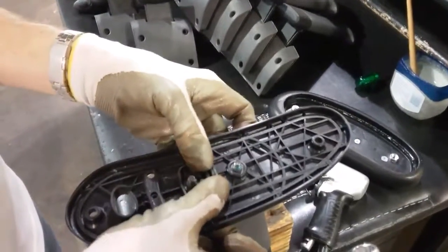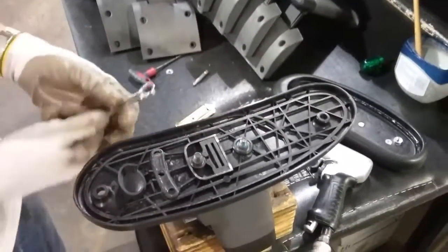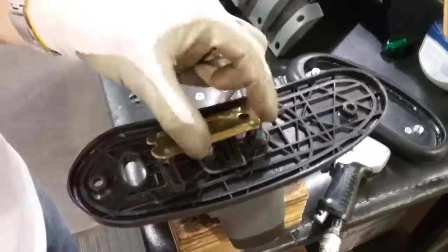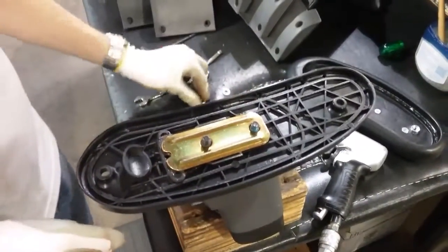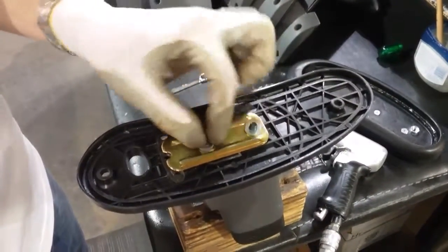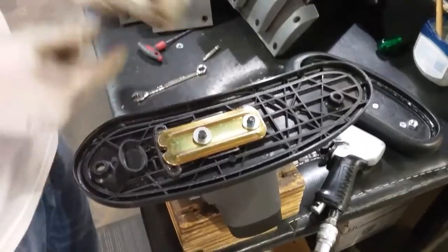I'm sorry, there's a piece there. You'll see a plastic piece goes in first. And then you're going to take your plate, put that on top of the 2 bolts, and put the washers and nut on top and secure those in place again.